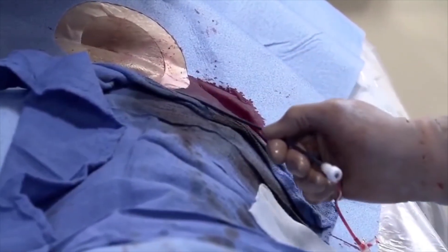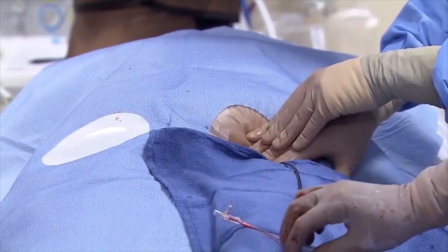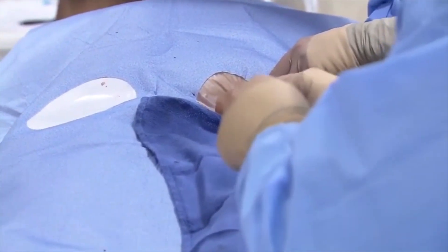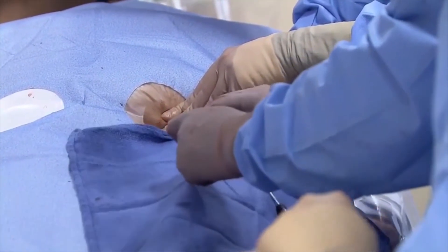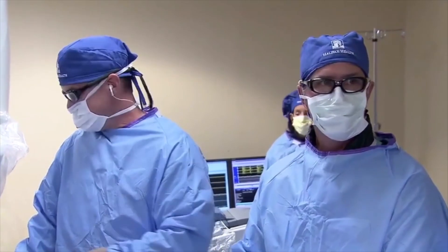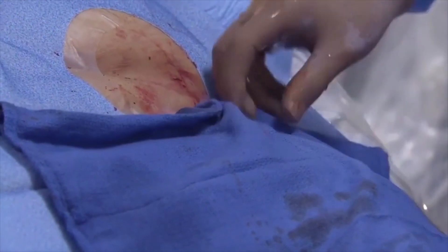We're going to advance the little retrieval catheter over the basket, and then the basket and the wire come out. We'll take a look at it on the back table. We're going to take a picture of the groin, and then we're going to close the groin with a suturing device. I'm going to apply pressure here — we've got a puncture in this artery at arterial pressure, the size of this catheter going into the skin. We're going to apply pressure to stop any blood from coming back through the puncture site while he gets the closure device in there. We're leaving the wire in so we can introduce the per-close suture. You can see the small size of the incision we made — just a little nick in the skin. We have good hemostasis and that's the end of the procedure.